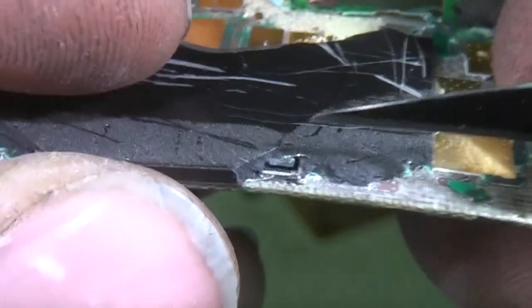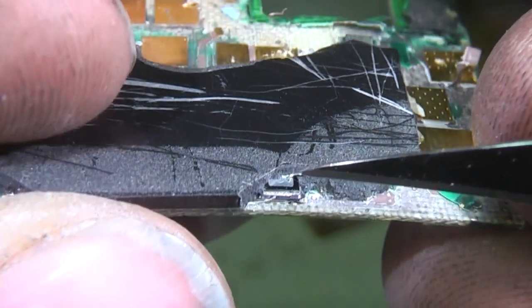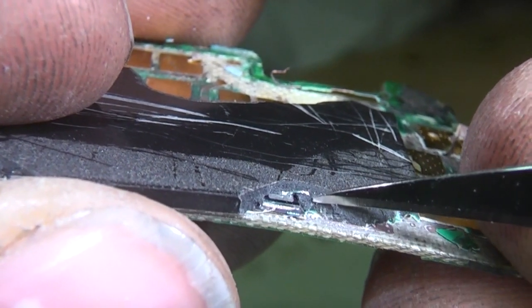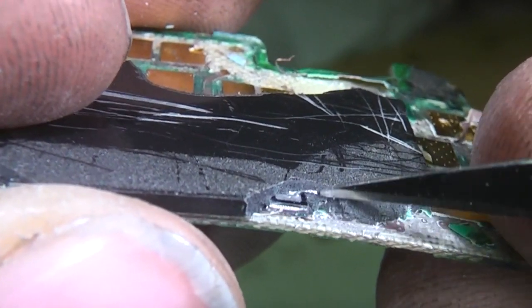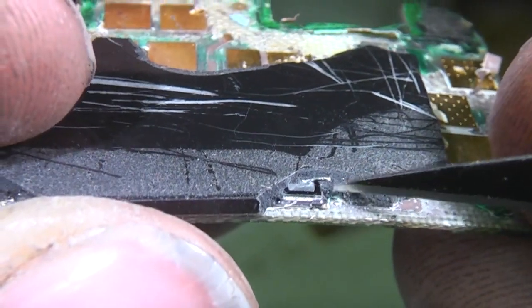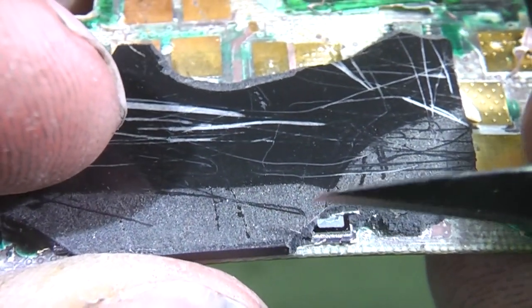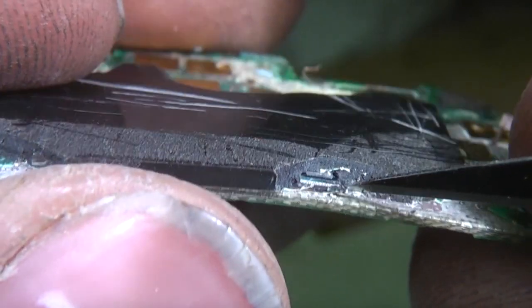And on this one you can actually see, I'm guessing this is probably a FET or something, you can actually see a bond wire going from the device down to the board. So this is, again, a bare device that's been put on the PCB and then bonded on to connect it. There's no obvious features on this surface. This is probably just one fairly large area of, say, maybe a diode or a MOSFET or something.